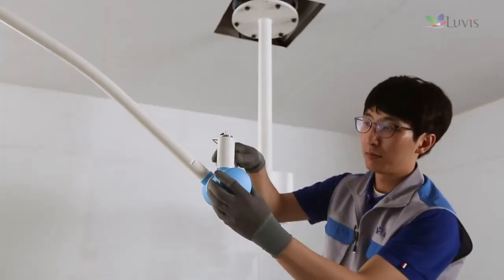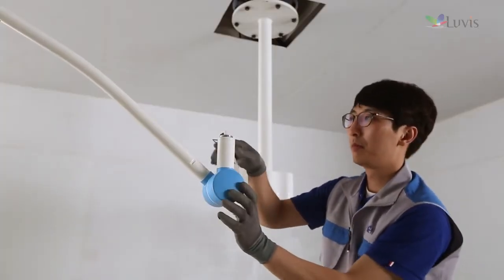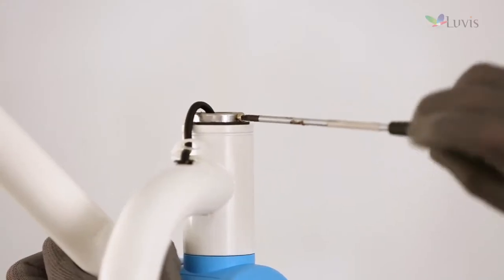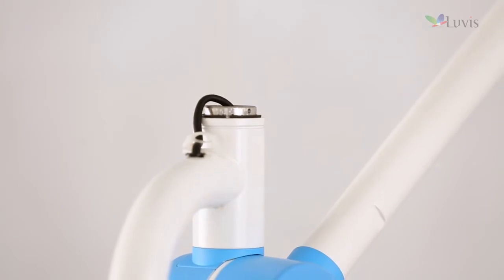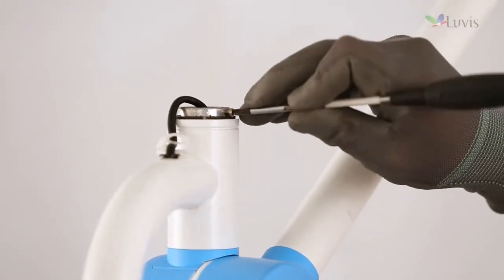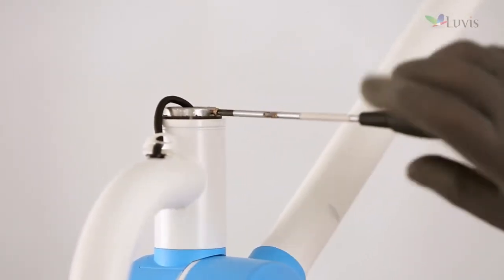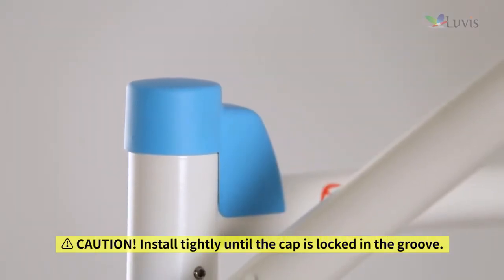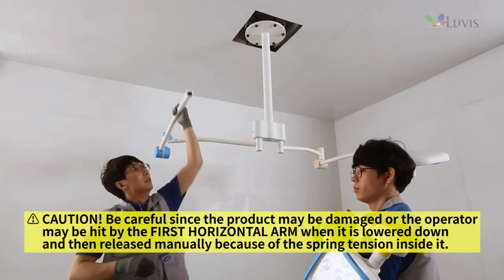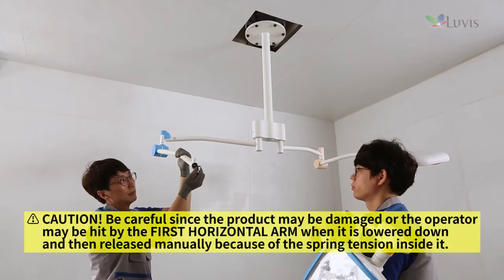After fixing the FE wire, put on the first horizontal arm joint cover. There are screw docking holes on each side of the first horizontal arm joint top. Tighten the M3 screw to the screw docking holes on both sides. Install the vertical arm joint cap. Hold the installed first horizontal arm with your hand and lower it down.